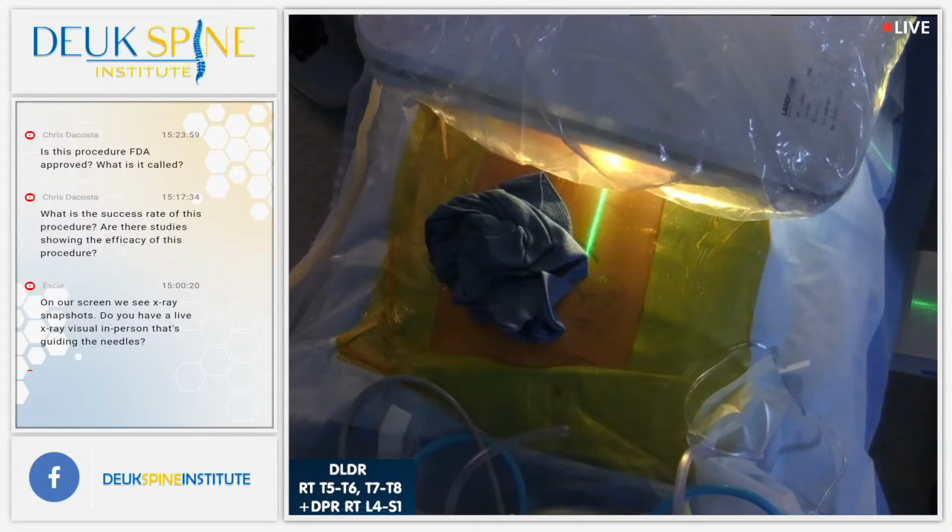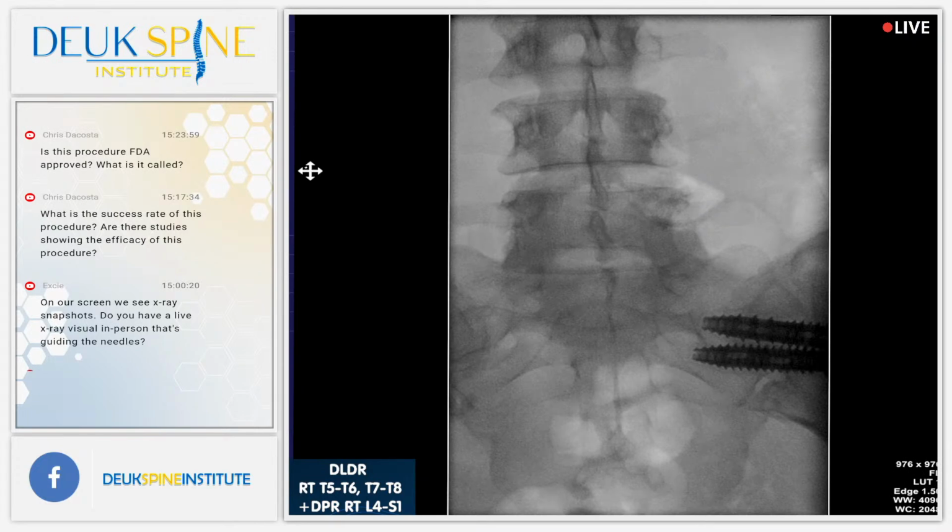All right, so let's just confirm it's 4551. Everyone agree? 4551, right side. So we're going to start by localizing the facet.